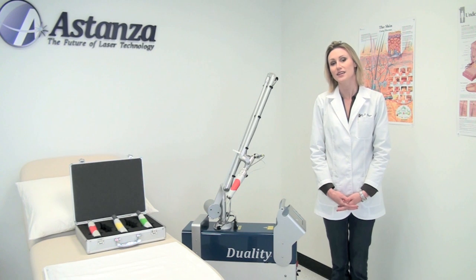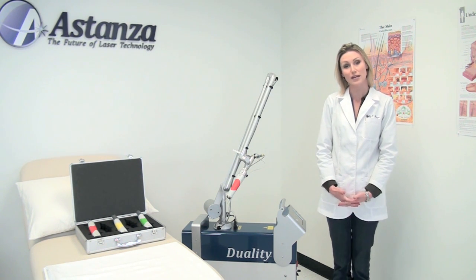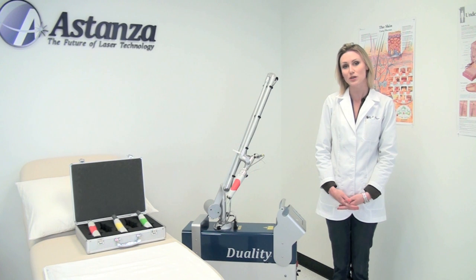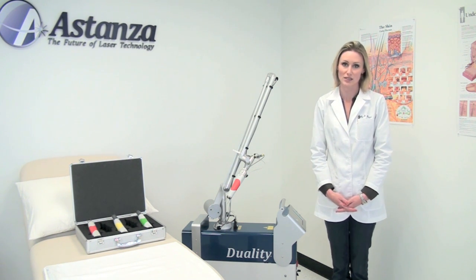Hello, thank you for joining us today. Today we will be looking at the Astanza Duality laser. It is our newest laser on the market for tattoo removal. It's an actively Q-switched ND-YAG laser, very powerful, very effective, and very reliable for removing tattoos.